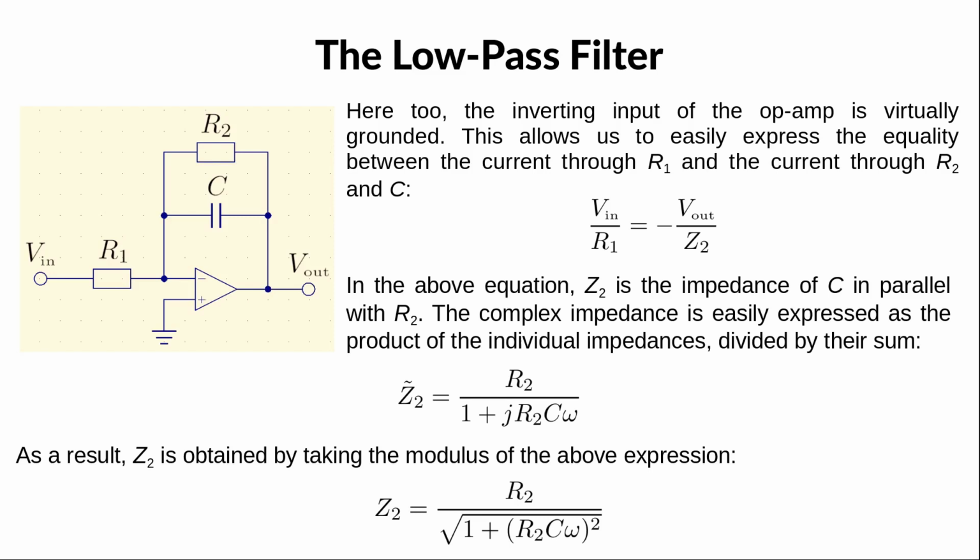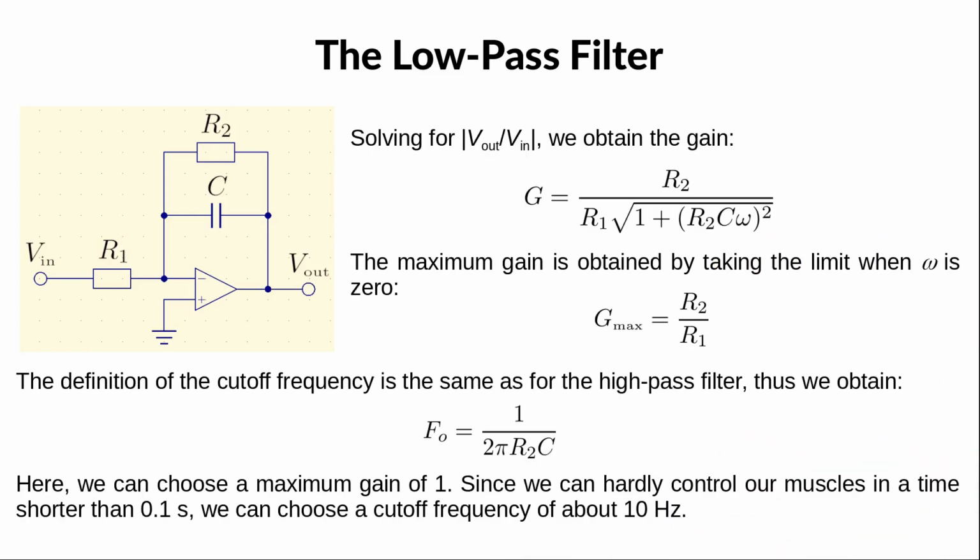The complex impedance Z2 tilde is easily expressed as the product of the individual impedances divided by their sum, so the real impedance Z2 is obtained by taking the modulus. By substituting this impedance in the first equation, we obtain the gain, which confirms that what we have is a low-pass filter. Indeed, it is easy to see that the gain decreases when the angular frequency omega increases. The maximum gain is obtained when omega is 0, thus Gmax equals R2 over R1.